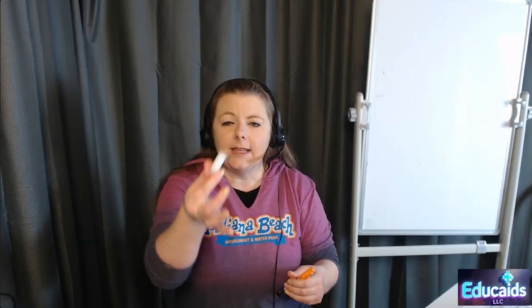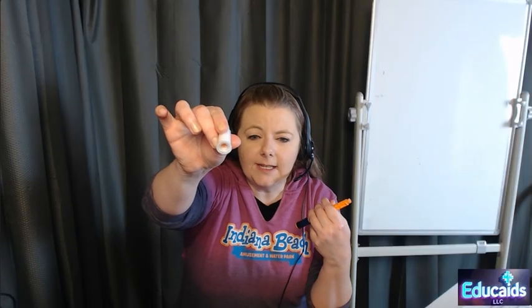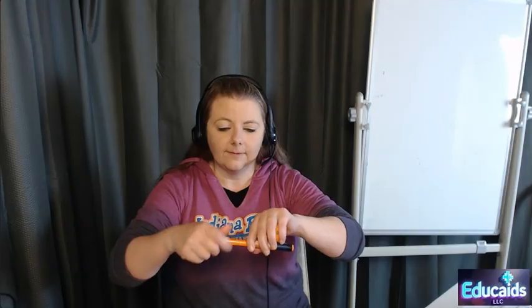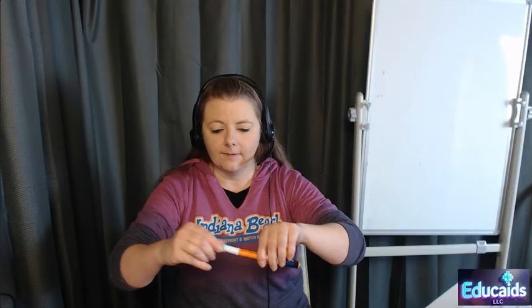And then these are the needles that we would have in the hospital. So we are going to open this up, and I want you to look right there. That's a needle, so don't poke yourself, all right? And can you see the orange is pretty far down on there? So after I've cleaned this with alcohol, we're going to screw this on righty-tighty. All right, so we've got this on.